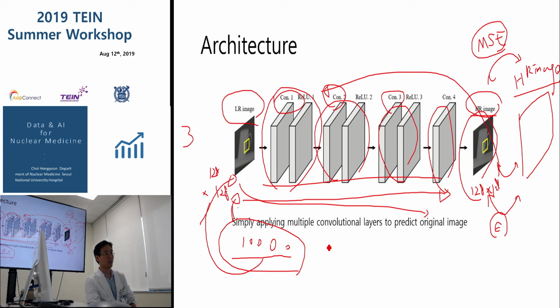So it depends on the healthcare purposes. Sometimes we need FDG PET for screening purposes, then we don't need CT or high dose PET anymore. We can use low dose PET recovered by a deep learning model, and the attenuation correction map can be generated by deep learning. So this will remarkably reduce the PET radiation dose. So it will defeat this whole body scan in that case? Yeah, right.